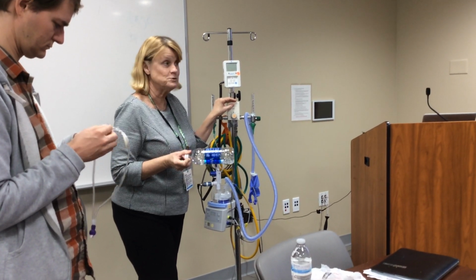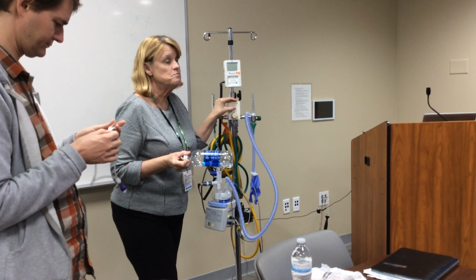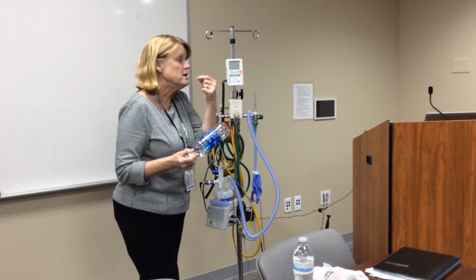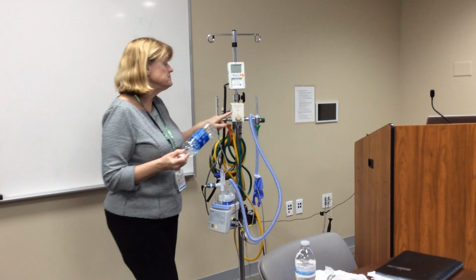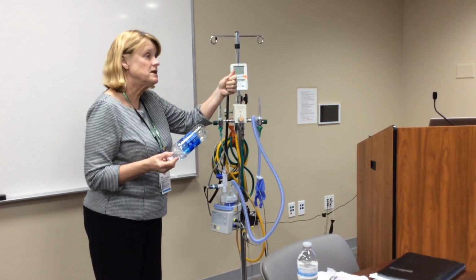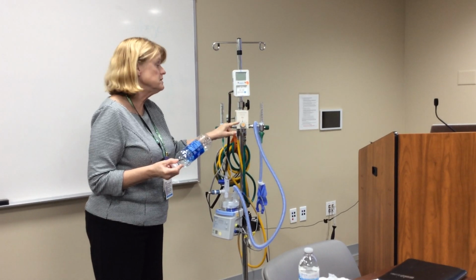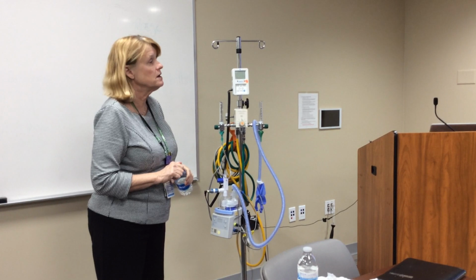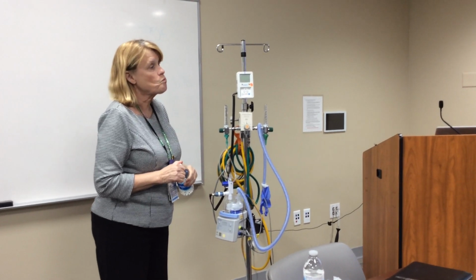For most of your patients, now you've met their minute ventilation, so they're not pulling in any room air. So whatever you have set on here is going to stay at that. If you increase the flow rate, the FiO2 is still going to be what's on the line. It'll still be 50%. You're just removing the trapped air.